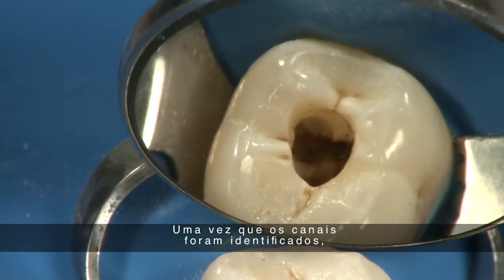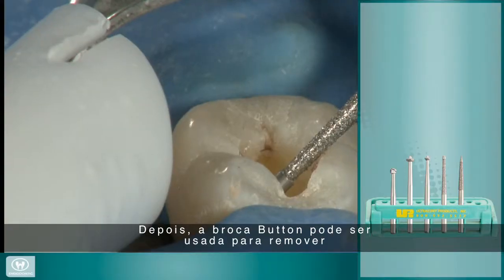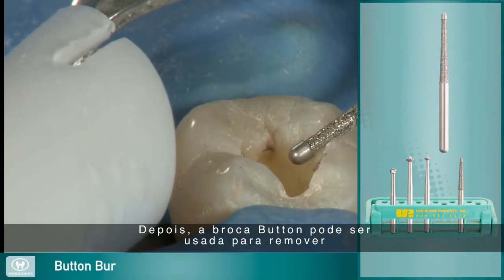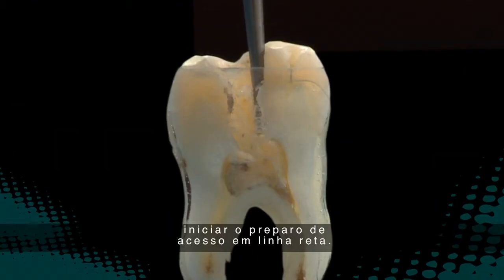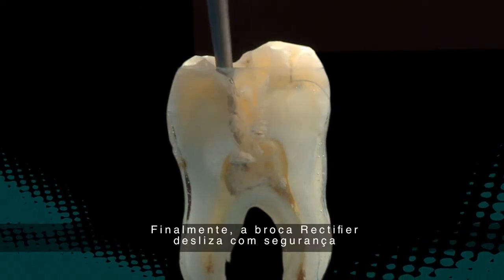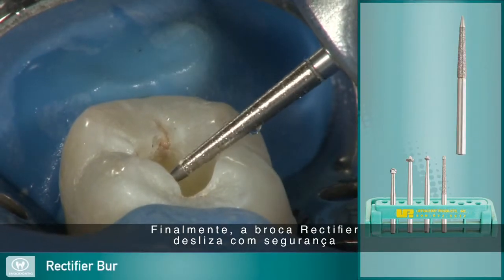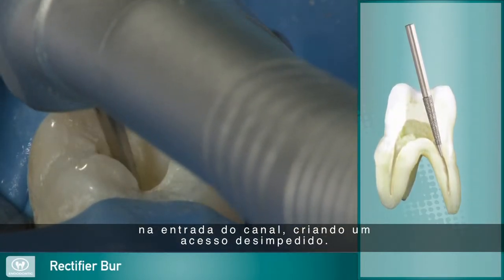Once the canals have been identified, the remaining access burrs are used. The button burr can be used to remove interferences, smooth out the access wall, and begin the straight-line access preparation. Finally, the rectifier burr safely slides into the canal orifice to finish a clean, straight-line access.